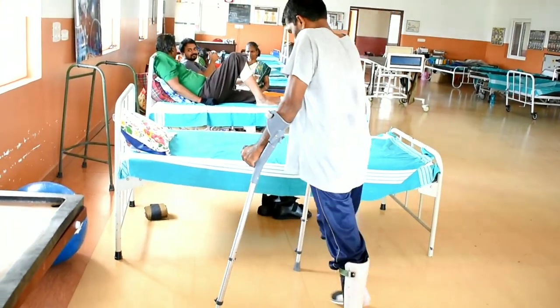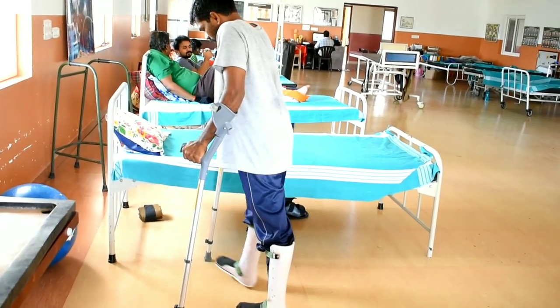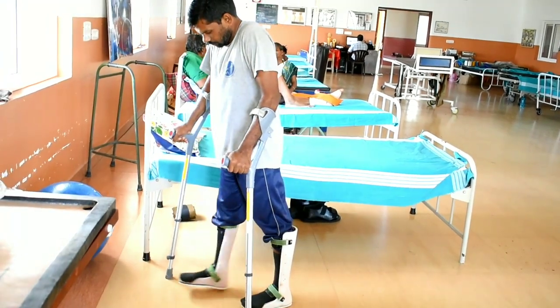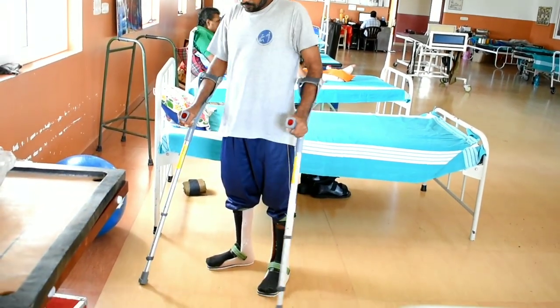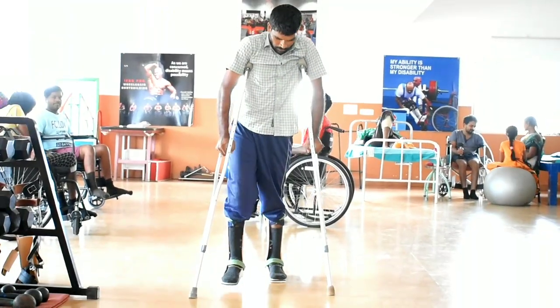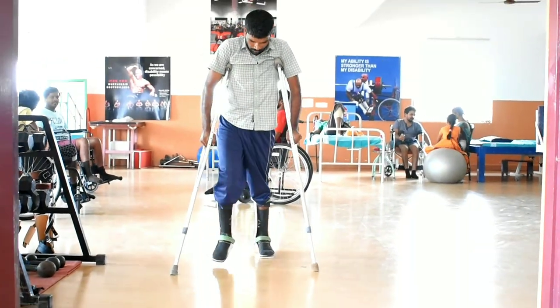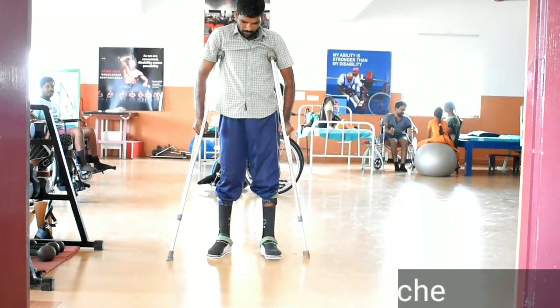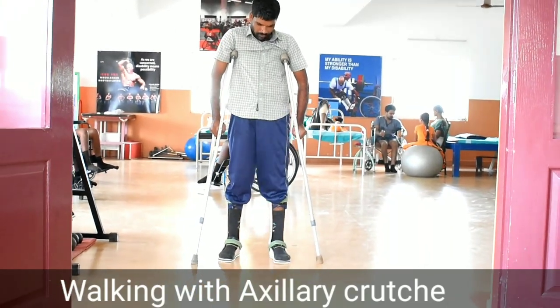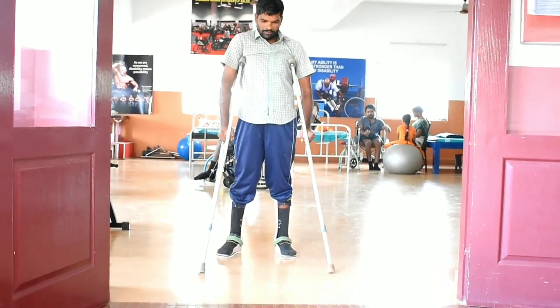Regarding transfers, for a person who walks with elbow crutches or a walker, the basic thing to teach is how to sit to stand from the bed or cot. This is an important consideration: when the patient has a difference in lower limb power, he can walk with elbow crutches, but sometimes it is not safe.